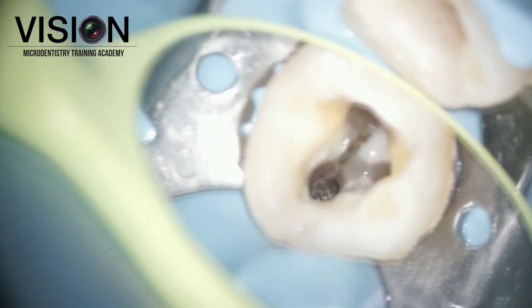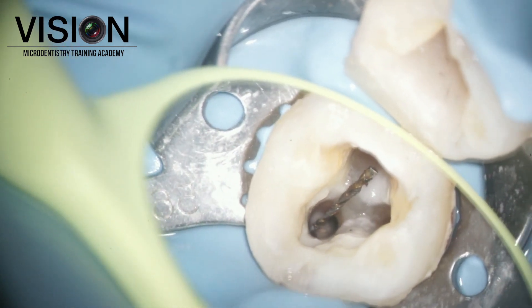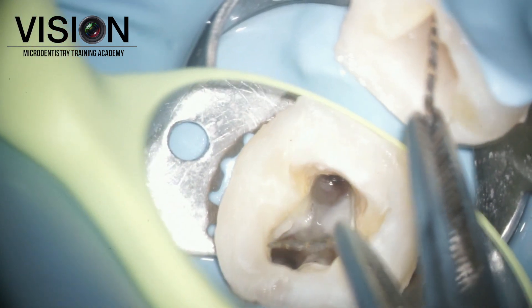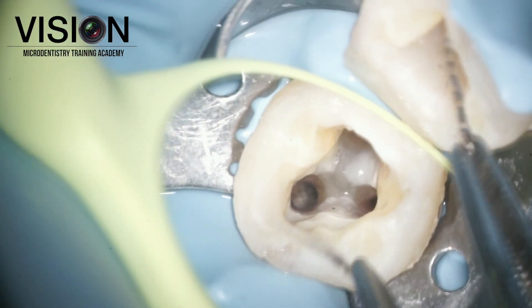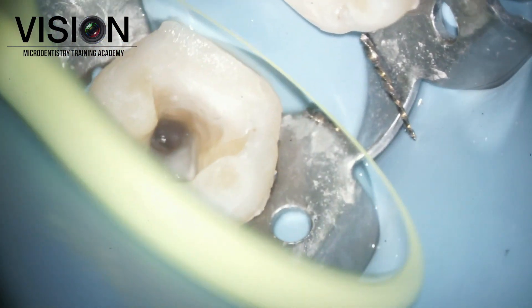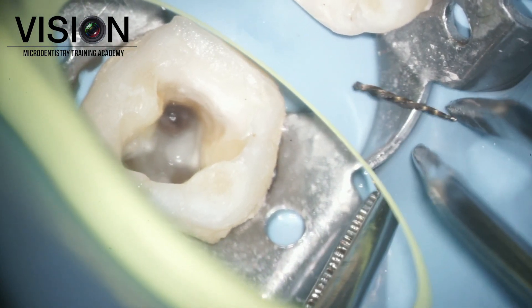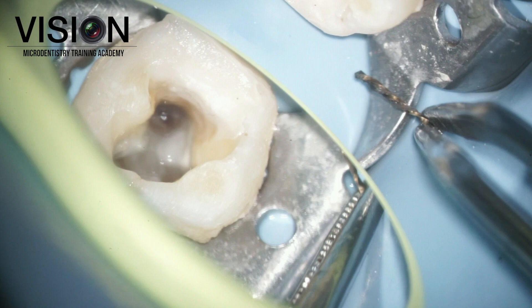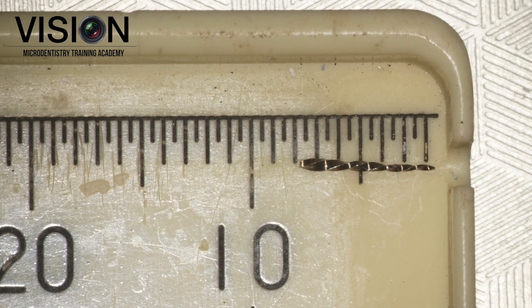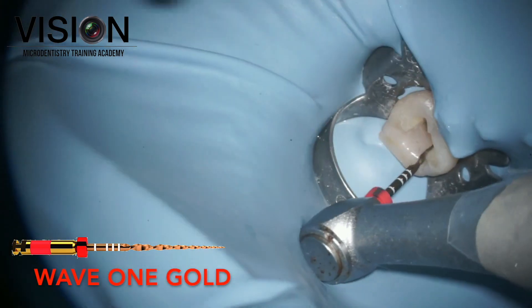Unfortunately, I lost the grip on the instrument because it was so long and the BTR pen loop was slightly smaller in diameter, but we managed to retrieve the instrument in total in one piece. You can see the entire fragment from the tip to the head of the instrument. We measured it for our records — it was about 8 millimeters, which is the reason why the instrument did not pop out easily.